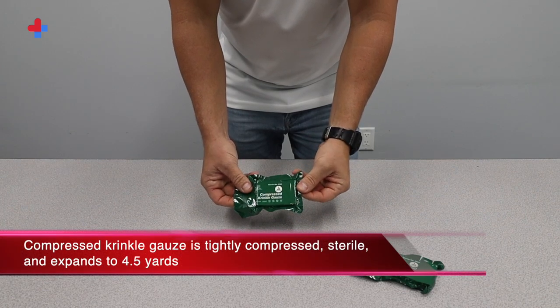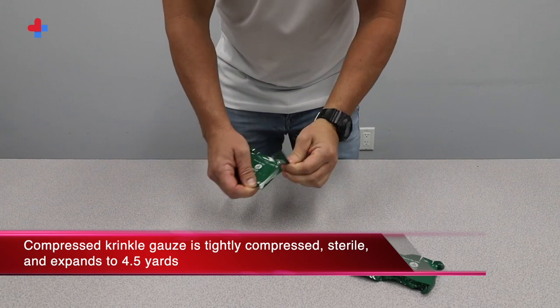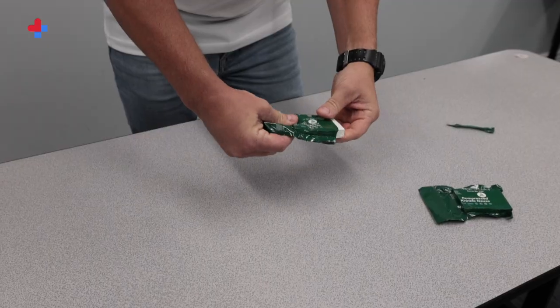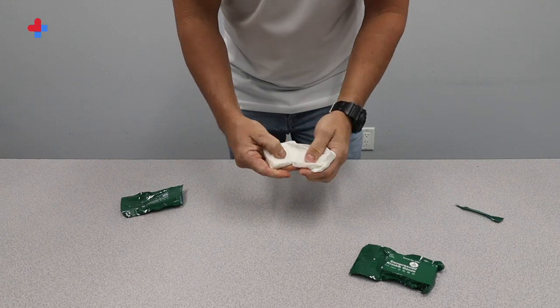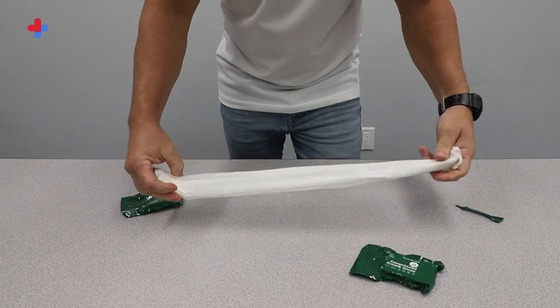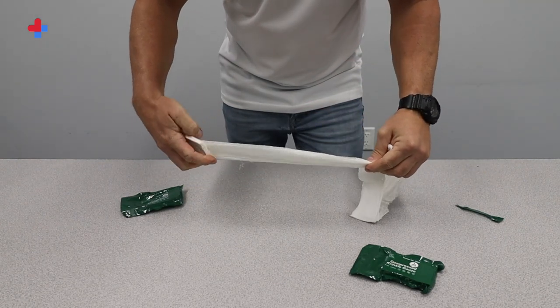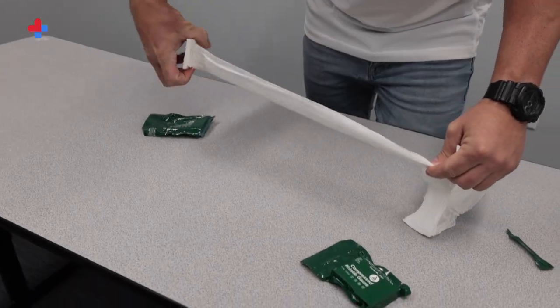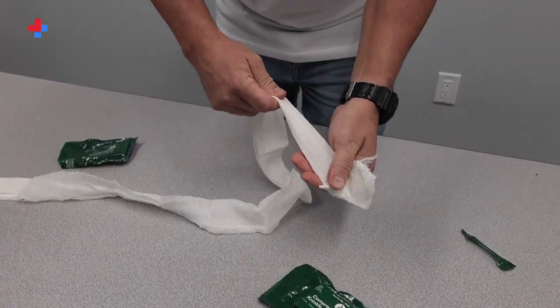Compressed crinkle gauze is tightly compressed, sterile, and expands to four and a half yards. To open the crinkle gauze, tear open the package. To begin using the bandage, start pulling off the gauze from the edge. As you can see, the compressed gauze will open to four and a half yards of soft, sterile gauze. The compressed crinkle gauze is the first line of defense against moderate to intermediate bleeding.